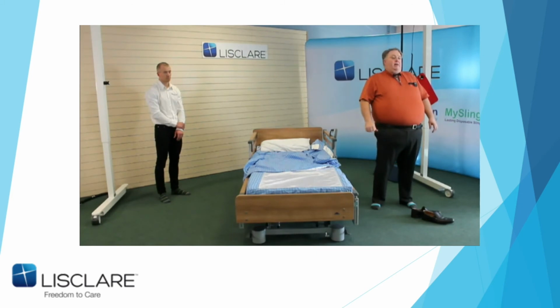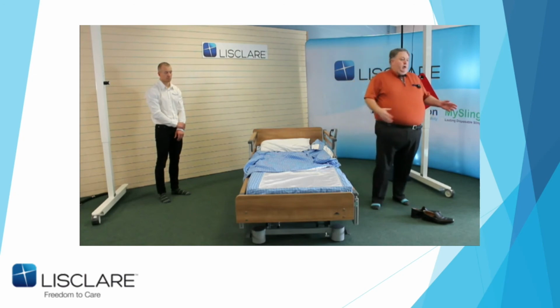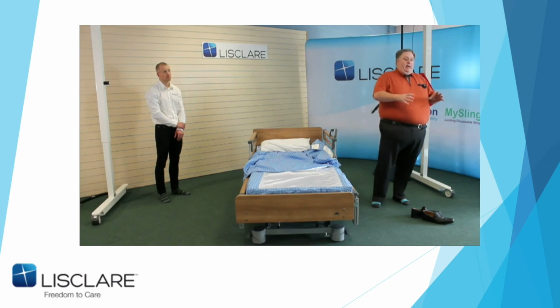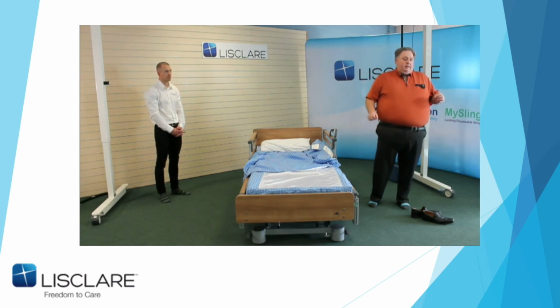What you're talking about is divan beds of 5 foot, 5'6", and 6 foot. If a person comes home terminally ill and wants to stay in their marital bed or their partner's bed, then we have sheets for that. But that's a unique situation where you have to go in with care and tenderness, because it's challenging. Normally I'm aiming at nursing beds, 90 wide, 120 wide. Once you go above that, you're in divan beds.